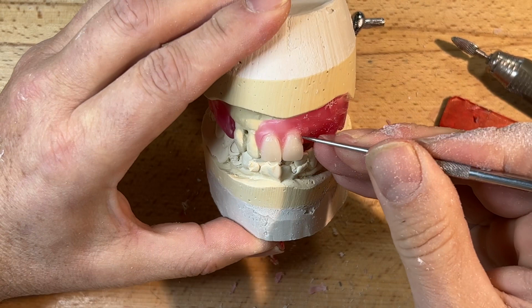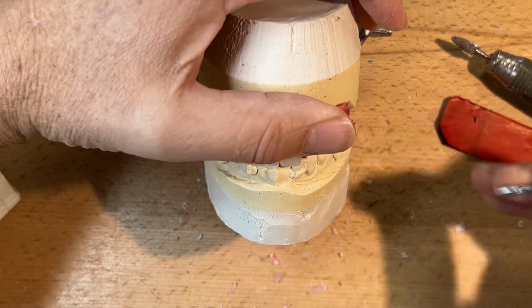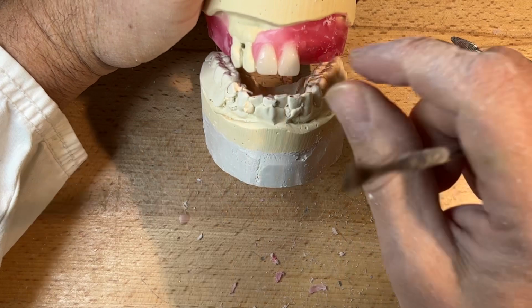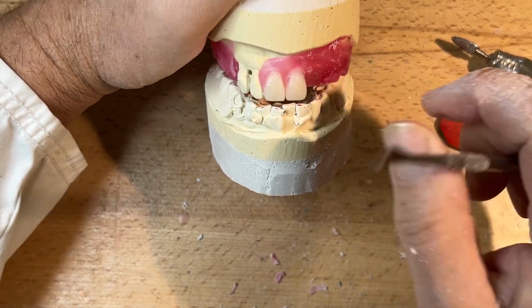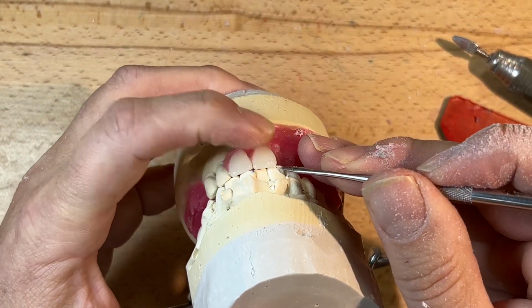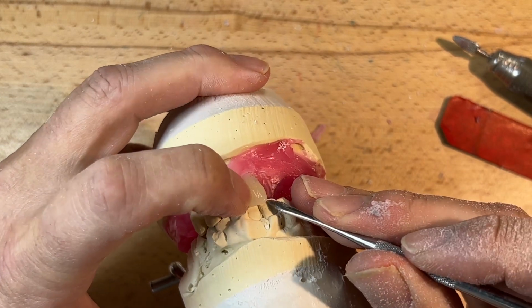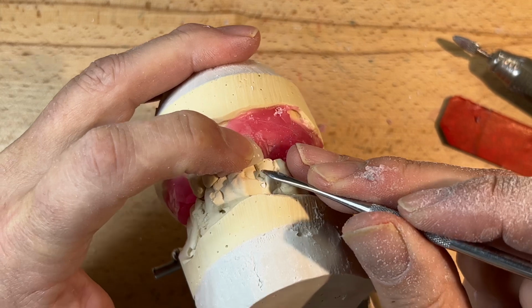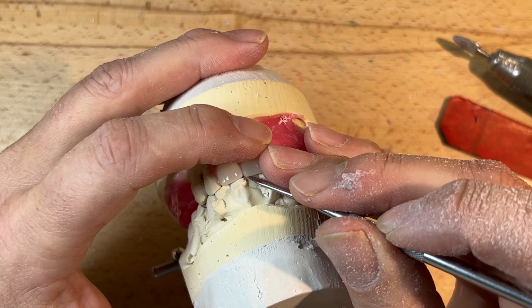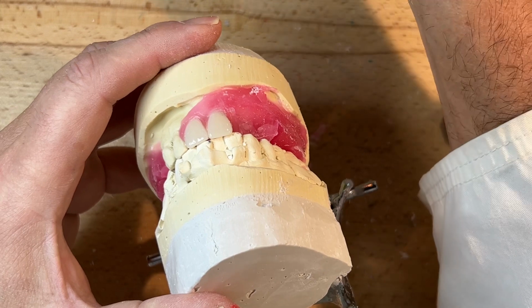Now, the next step is a wax up, so I'm waxing up at the same time. I need to keep this clean so I can see how the emergence angle is coming out. And you can see here what I've done, kind of elongated the central. Maybe the midline is spot on. I can look here occlusally to see if I have contact and how much contact and if I have any overjet. Like I said, in this case, I'm going to minimize the overjet and minimize the overbite, but we will have contact in centric occlusion. If this was a full upper against a full lower, obviously I would have maintained overjet.